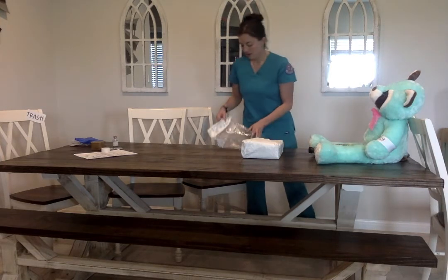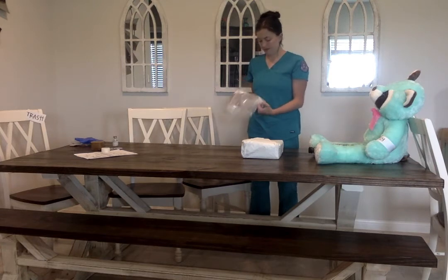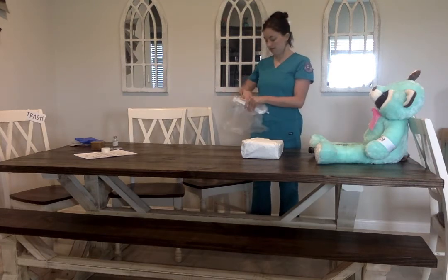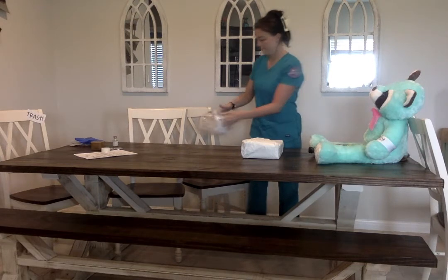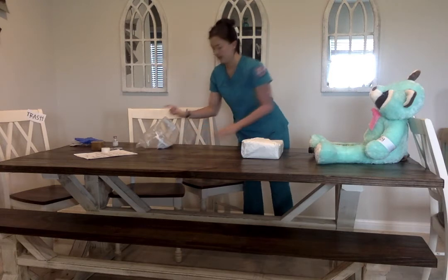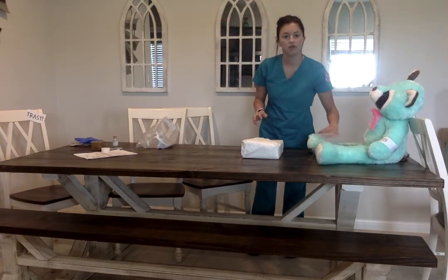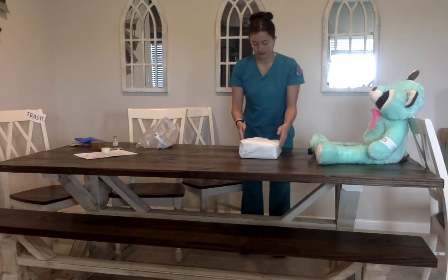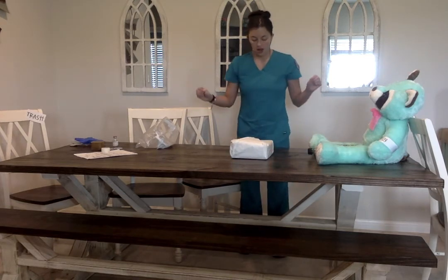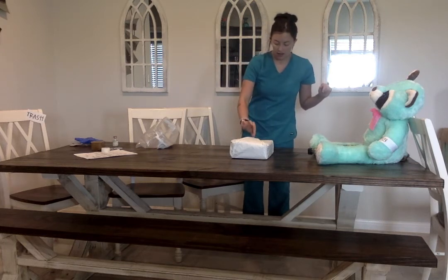Okay. I'm going to go ahead and set up my waste receptacle.